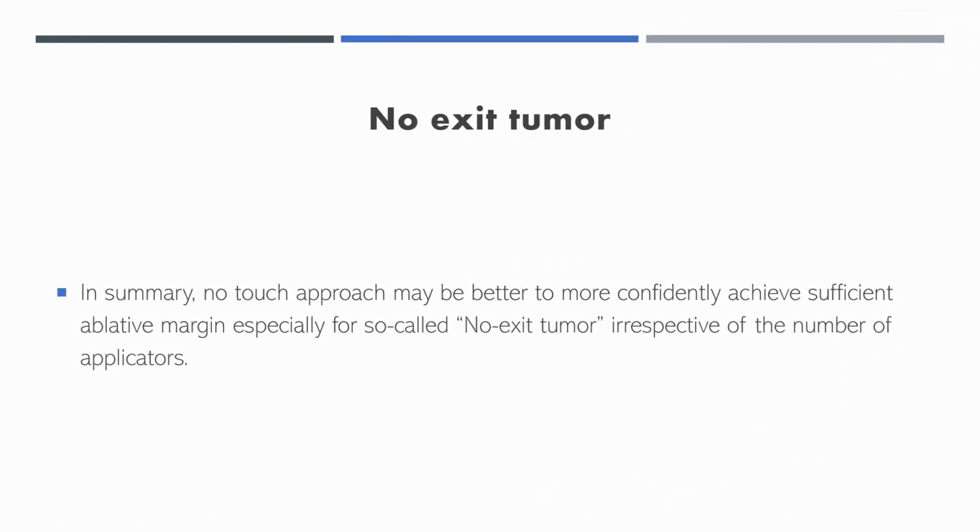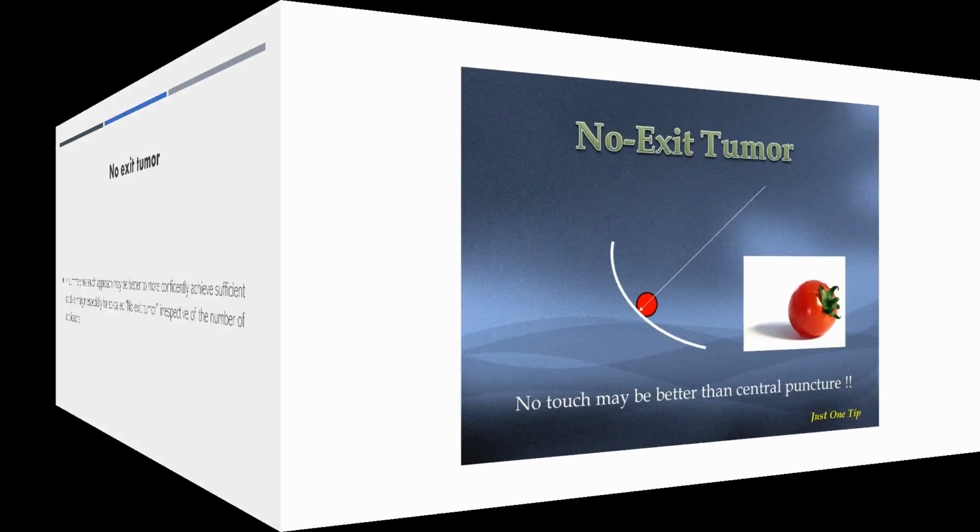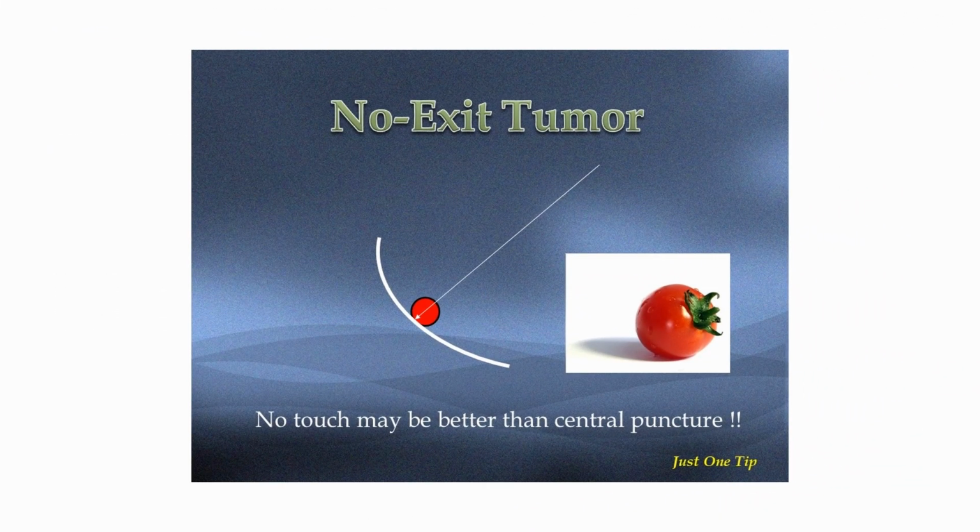In summary, no-touch approach may be better to more confidently achieve sufficient posterior ablative margin, especially for so-called no-exit tumor, irrespective of the number of applicators. No touch may be better than the central puncture, especially for no exit tumor.